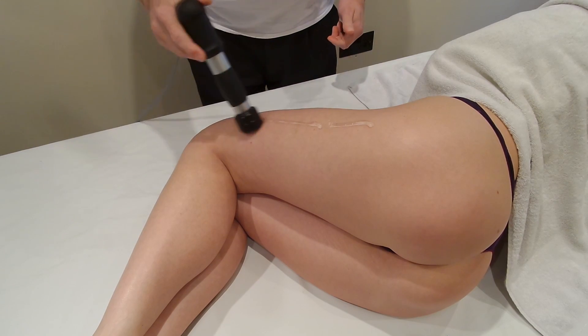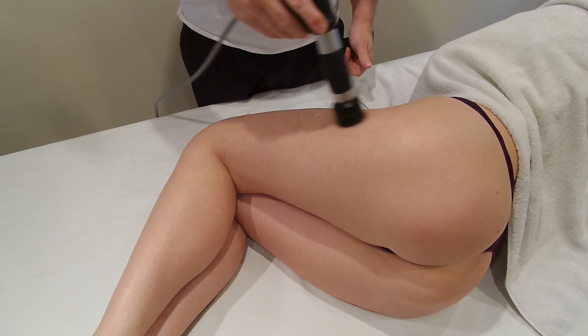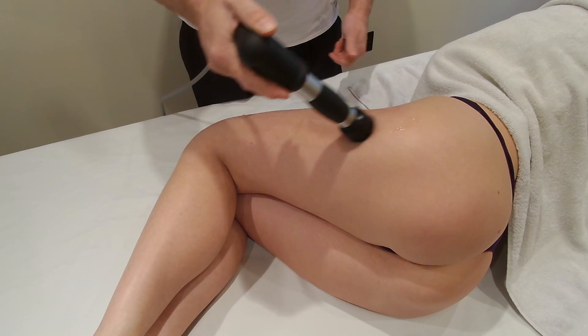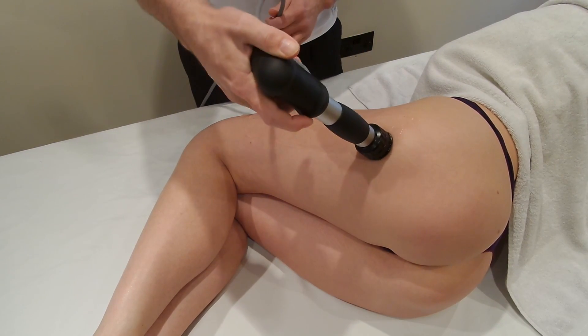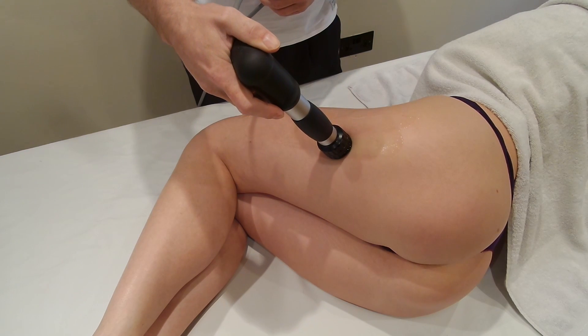We're going to be coming up above the hip, just down below the knee. There are certain points on this that tend to be very tender, where the greater trochanter and the greater trochanteric bursa is. That can be a very tender area. It can also be tender as you come across the knee on the lateral joint line.